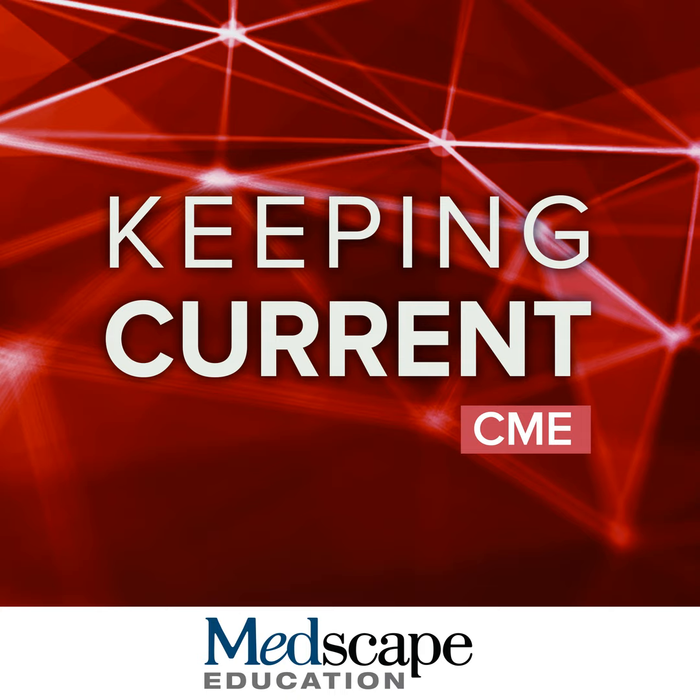So for LI-RADS 4, it's quite different because the risk is higher. If it's less than 1 centimeter, you can afford to follow these patients for 3 months. And if the lesion is stable for approximately 2 years, you can downgrade to LR-3, although the data is very small at this point, but that's pretty much what we do in our institution. And if the lesion grows, you can consider either a biopsy or an early follow-up.